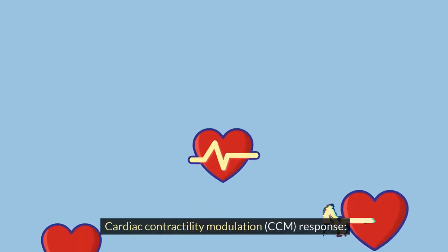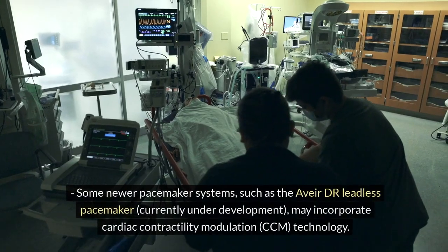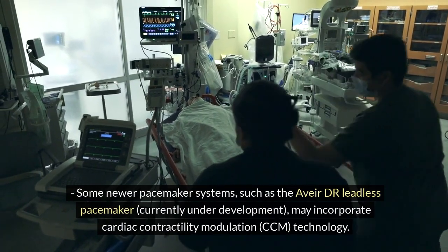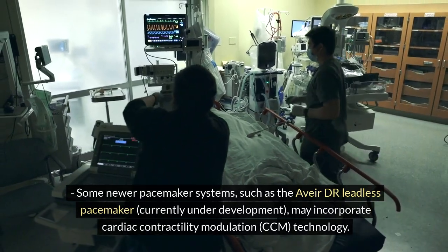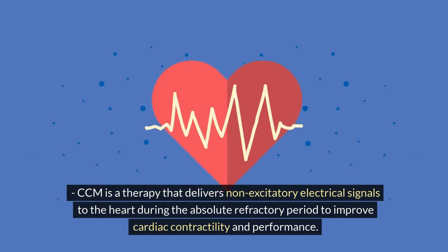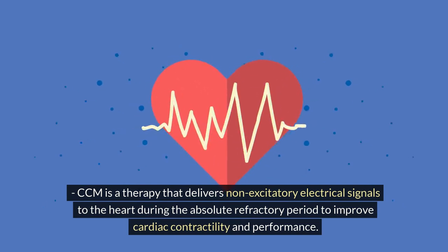3. Cardiac contractility modulation, CCM, response. Some newer pacemaker systems, such as the AVEIR DR leadless pacemaker, currently under development, may incorporate cardiac contractility modulation, CCM, technology. CCM is a therapy that delivers non-excitatory electrical signals to the heart during the absolute refractory period to improve cardiac contractility and performance.